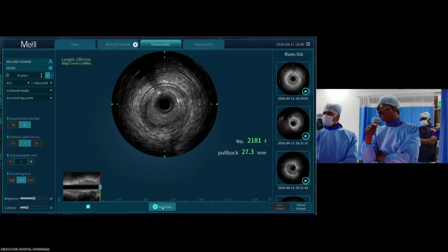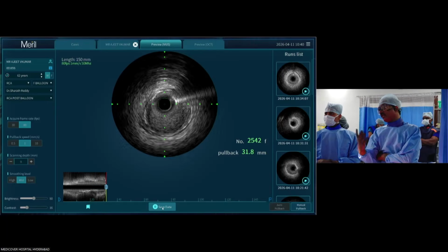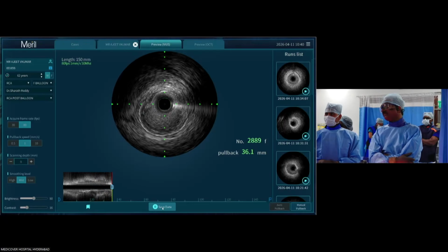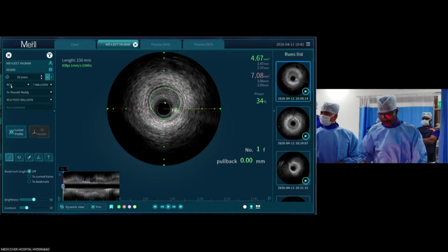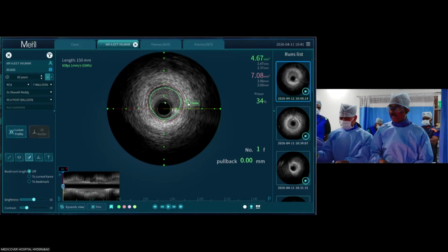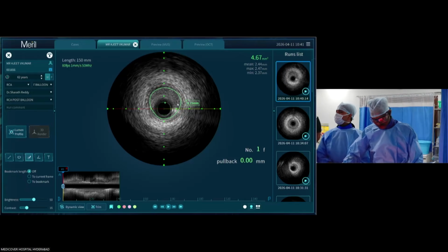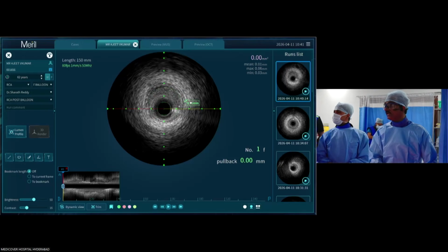That's the primary reason why I preferred taking a JR, because I decided this case is primarily retrograde, and JR also provides the comfort of easier externalization than AL. It's a choice. I do prefer AL in most cases, but if I'm just going retrograde and there is not much calcium, then it is reasonable to take a JR, because that is a better guide for externalization than AL.